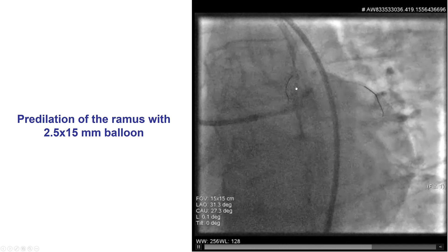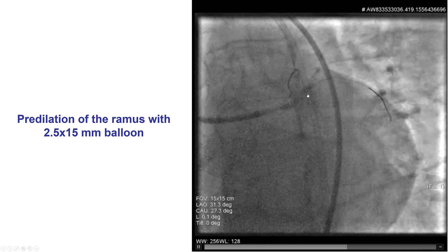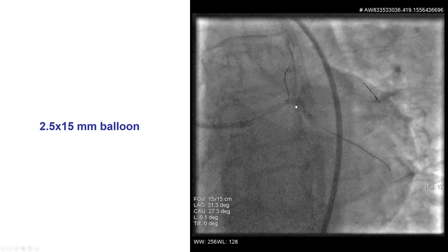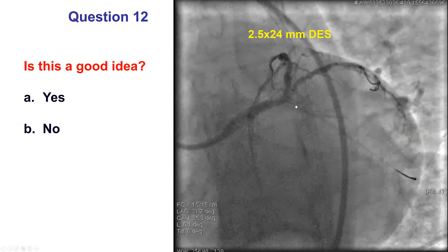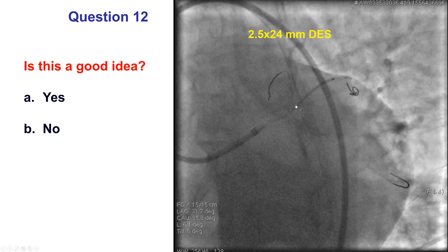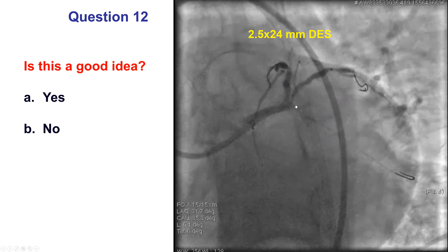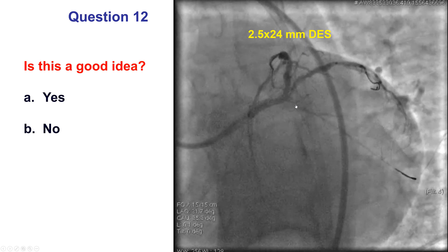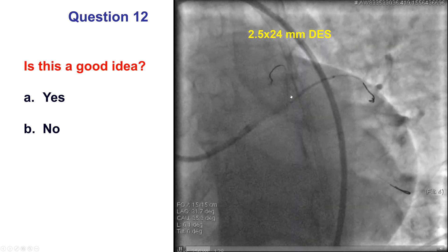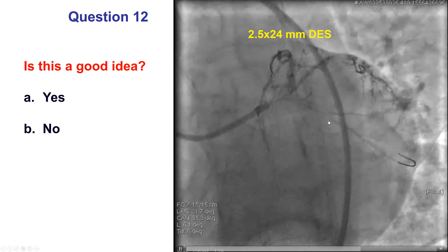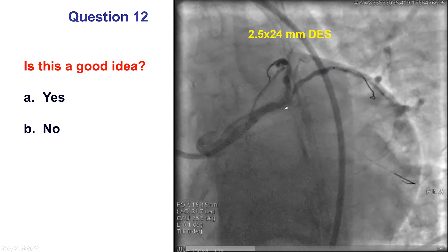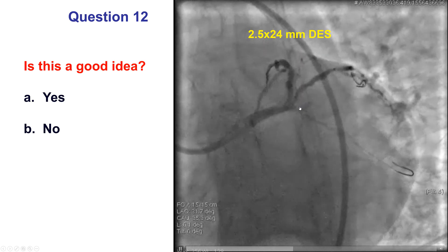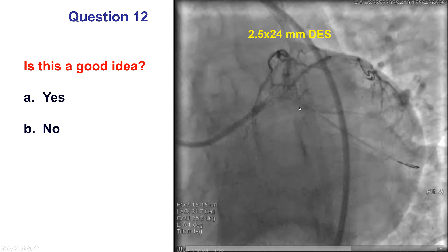We predilated — we had already stented the LAD — and now predilated the ramus. Trifurcations are hard to treat because there is no really established technique. In this case we had a stent in the LAD. We decided to place a stent into the ramus and do provisional stenting to the circumflex. Retrospectively, that was not a good idea, because we already had sluggish flow into the circumflex after predilatation. In retrospect, we shouldn't have done that.